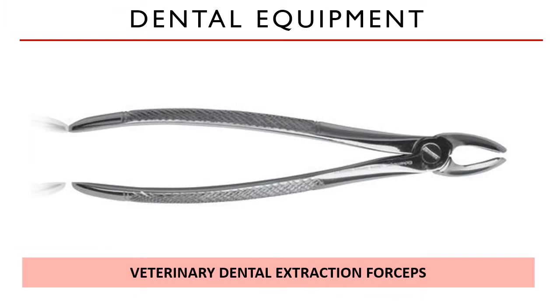Dental extractions are done with specialized dental extraction forceps. Now, you might see in practice that hemostatic forceps are used to remove teeth. Well, our motto in this country is basically if it gets the job done, then don't complain. But be careful with your instruments. Unless you bought your instruments for like 100 pesos a piece, then you would expect that the quality is quite low. Then sure, use it whatever way you want. But a lot of these instruments are devised to do their jobs because you would want to protect your instruments from the wear and tear, so to speak, with common instruments.